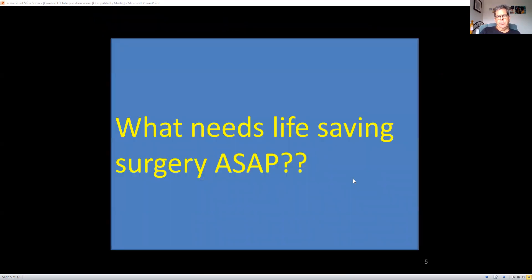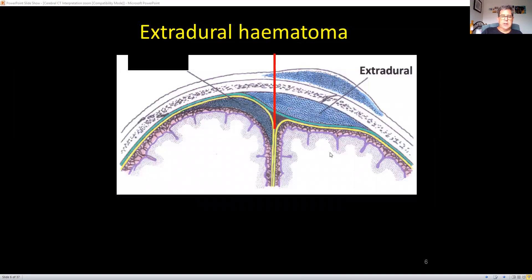The most important finding from a trauma point of view that may require life-saving surgery is the extradural hematoma. The extradural is a collection of arterial blood between the table of the skull and the dura. It's limited by the cranial sutures — I've put a red line down the centre of this picture because it shouldn't go past that point. As it strips off the dura, it can only go a certain length and then has to go inwards, causing compression of the underlying cerebral tissue.